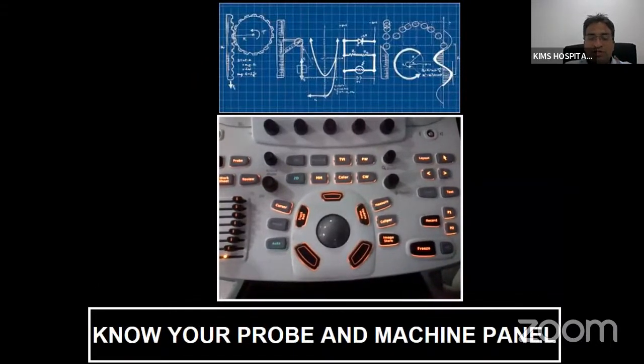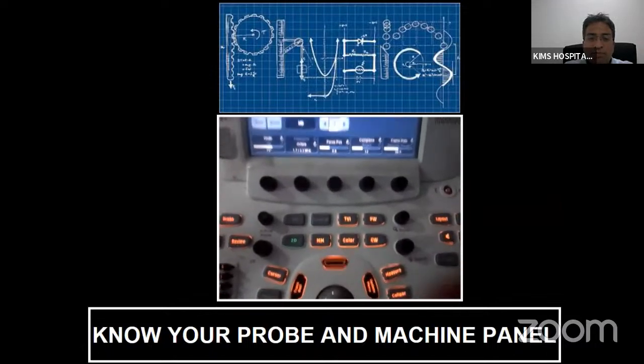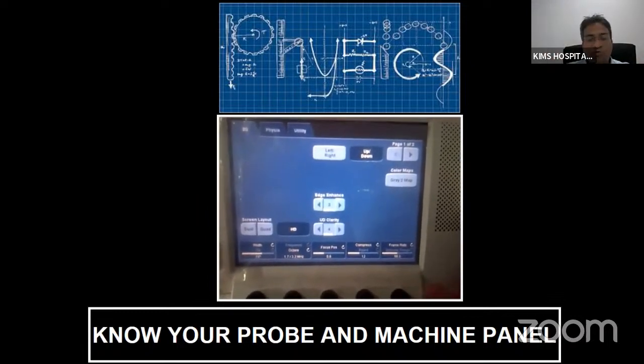So these are the two things. This is the machine, and you can see the probes. There are so many probes, but you don't need to know all of them. You should know the basic physics of the machine, where the screen is, where the buttons are, and how to change settings.